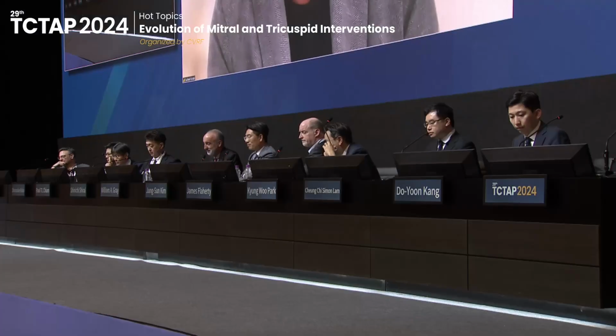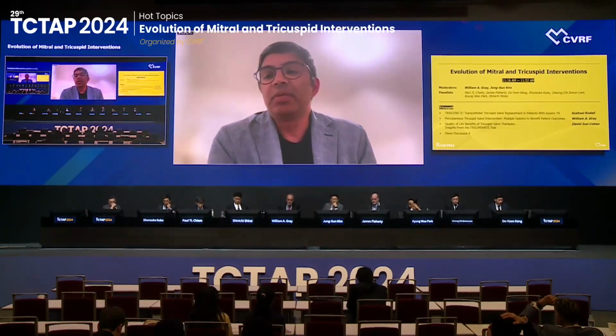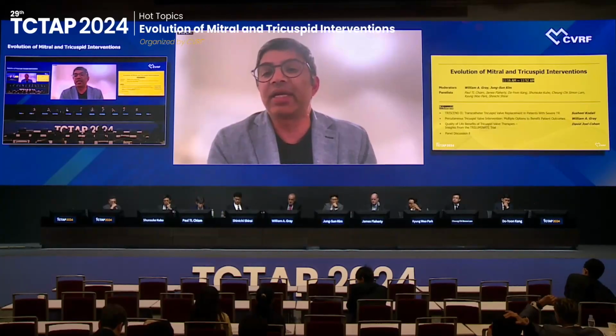Yeah, quick. It really depends on what kind of result I think I can get. If I have really favorable TEER anatomy, an atrial functional TR, I have a low threshold to do edge to edge. But if there's torrential TR and 5 leaflets, I'm not confident I'm going to get a good result. I lean towards replacement as long as I can anticoagulate the patient.